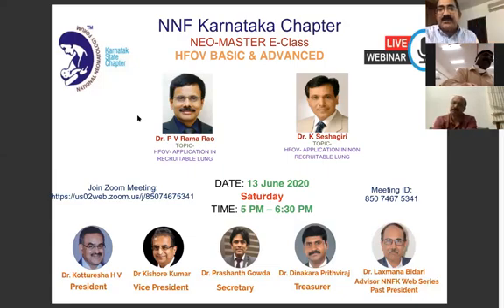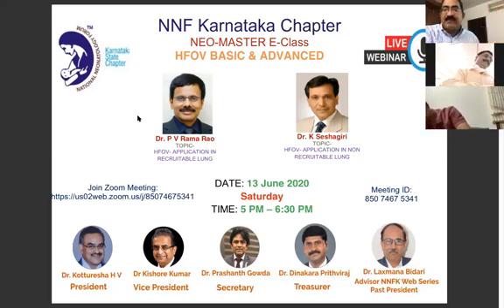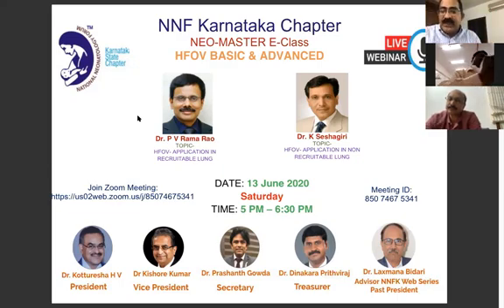So my advice to you, doctor, is don't go by what the book says. Just go practically. Look at the child and see. The basic principle is a sicker child will need a higher amplitude and a lower frequency. And once the child is getting better, the child will need a much lower amplitude and a higher frequency. So get down the amplitude first and then slowly increase the frequency to 10, 12 and even 14. Once you are around 12, 13 or 14, your child is ready to be extubated. That is more important than trying to follow a principle or a tabular algorithm.